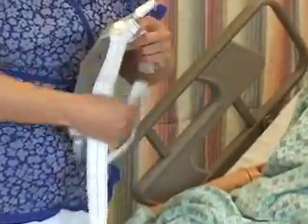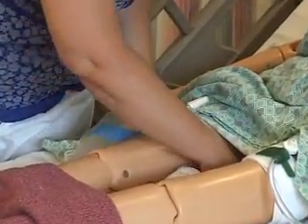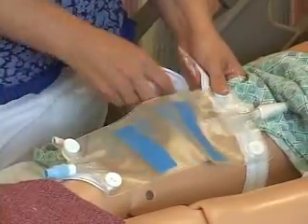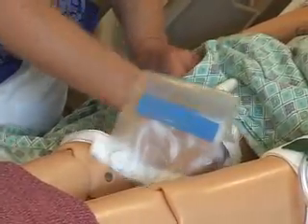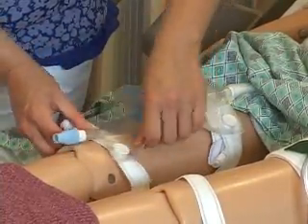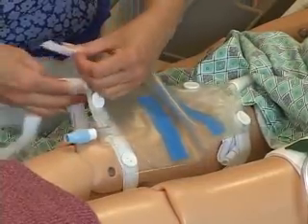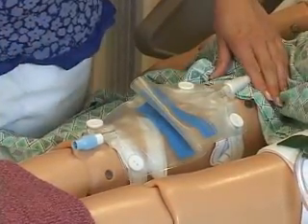again, these are Velcro. These, again, fit around your upper leg. And they should lie flat with no twists and be wrapped snugly, but not too snugly. The bottom strap should go around the bottom part of your upper leg, not below your knee. And this way to help, again, keep the slack in the catheter.